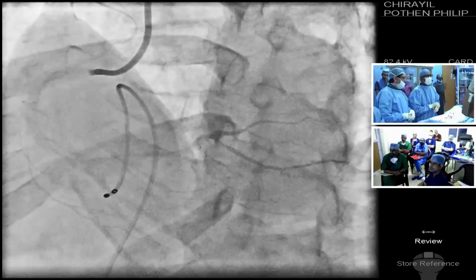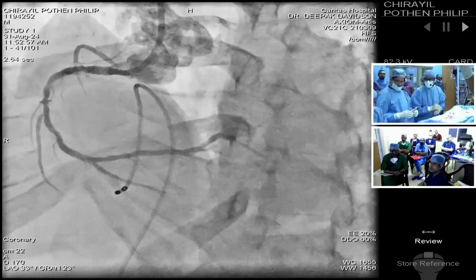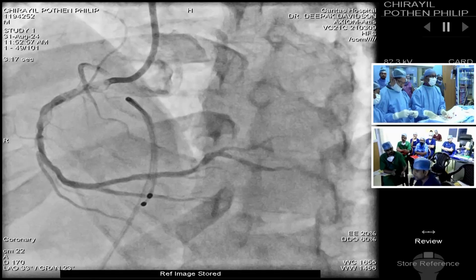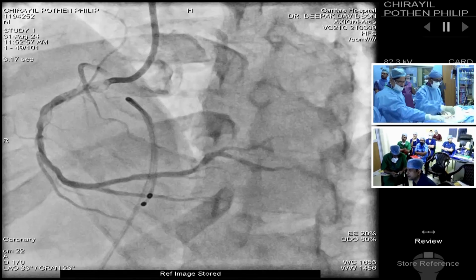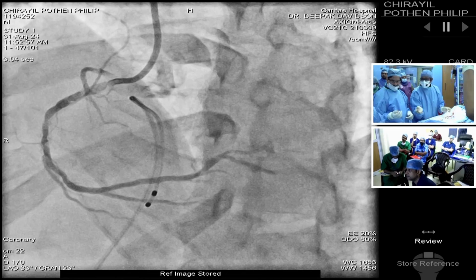In the concave side, thicker calcium is there, and concentric calcium also, on the inner curvature. Vishnu, can you hear us? Yes, sir, I hear you clearly. Can you hear both of us speaking, Dr. Kapardi? Yes, sir. Wire?